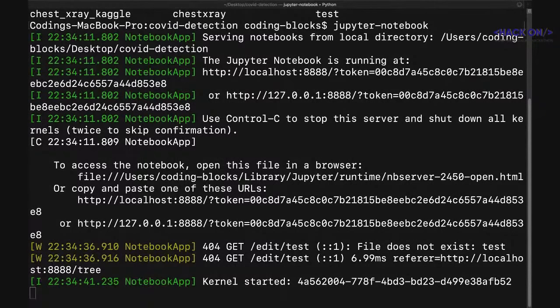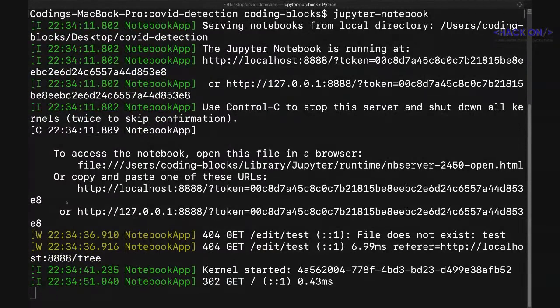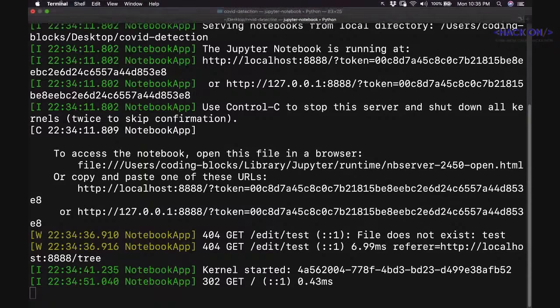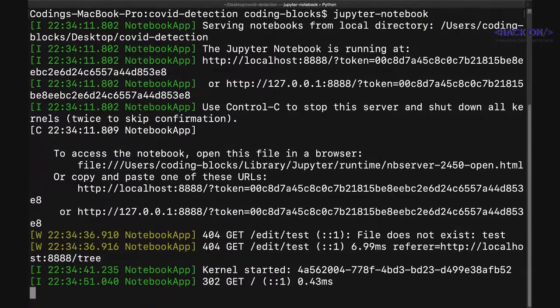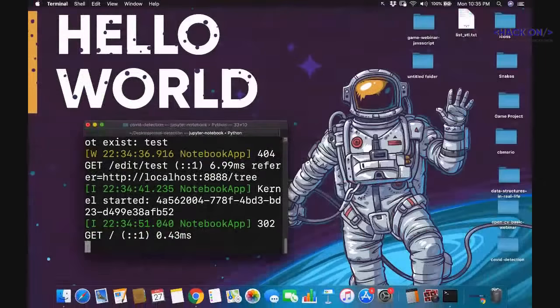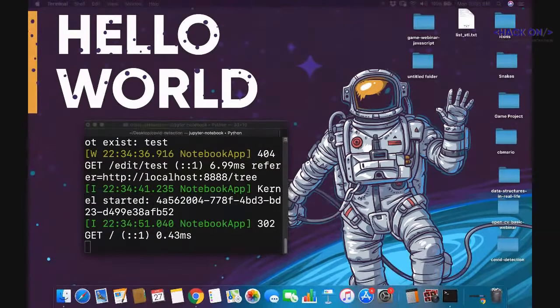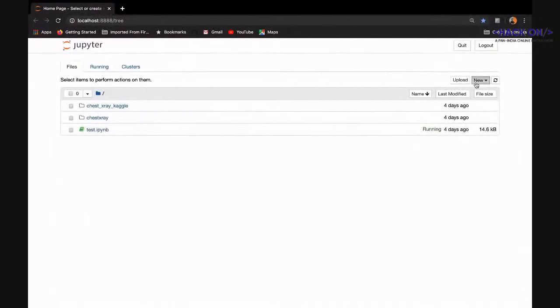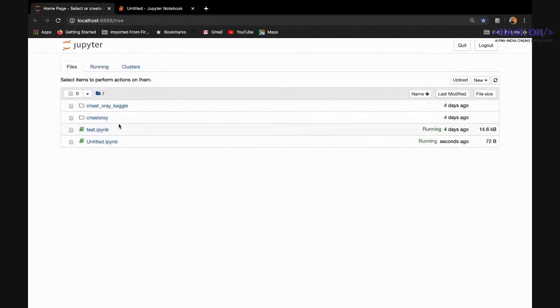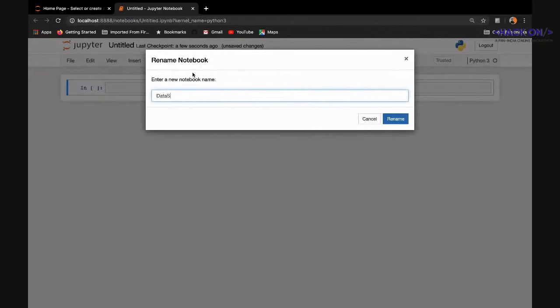We've set up a local Jupyter notebook. Let's try to create a dataset. Let's create a new file and call it 'dataset creator'.